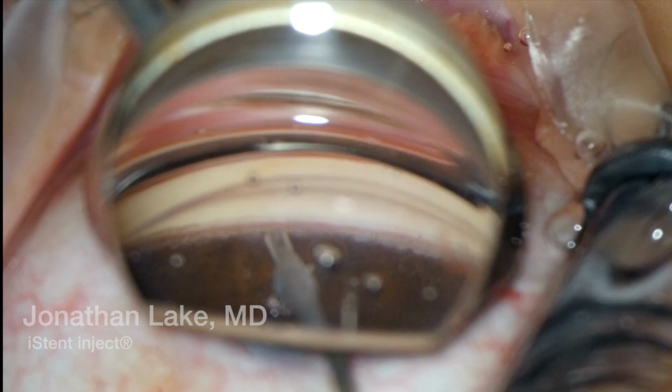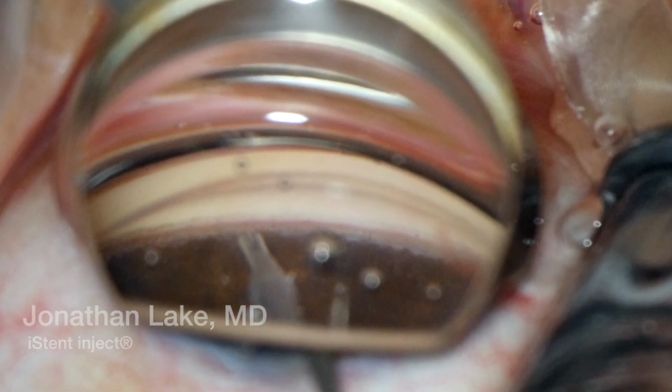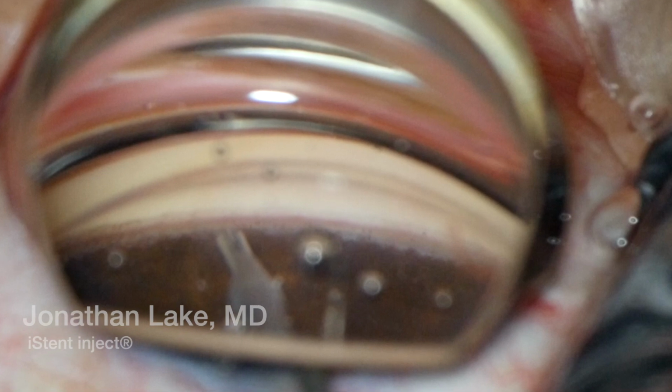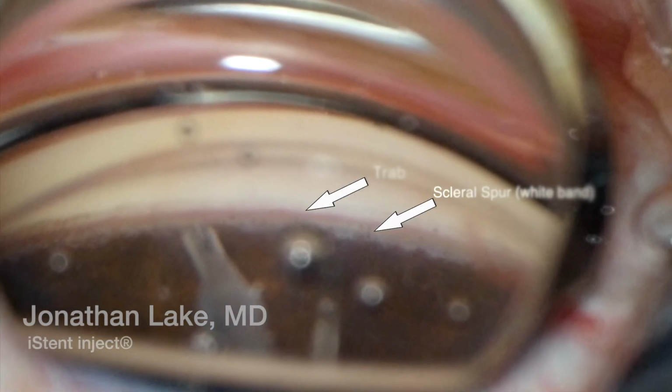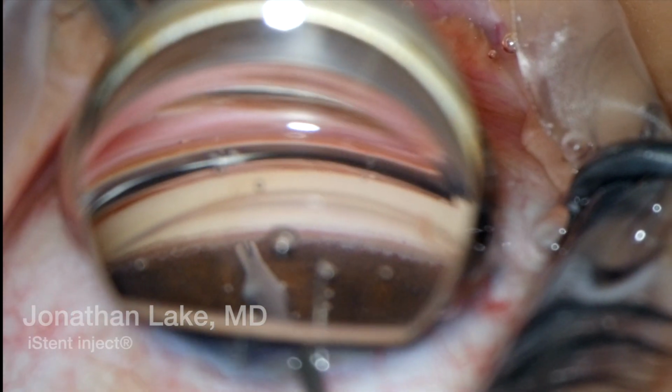First and foremost, for the cataract surgeon, it is very important to identify the structures, and gonioscopy 101, identify the scleral spur, then the trabecular meshwork. With that, you'll be very successful in finding your way.